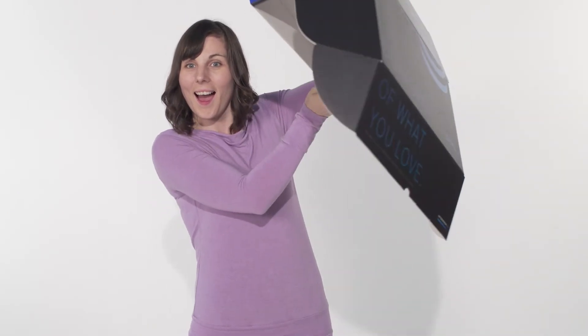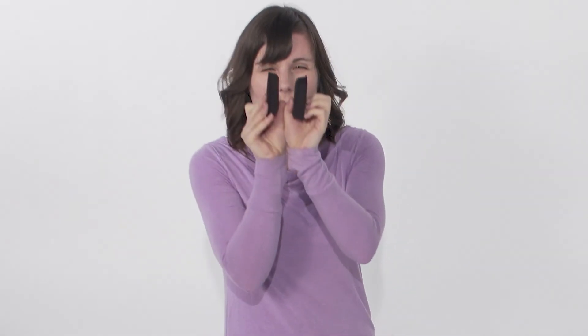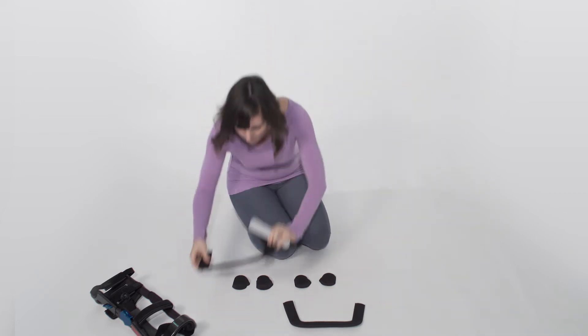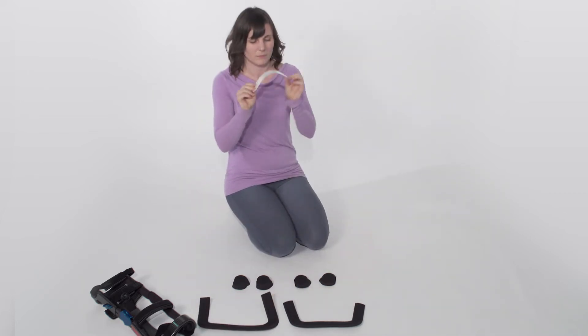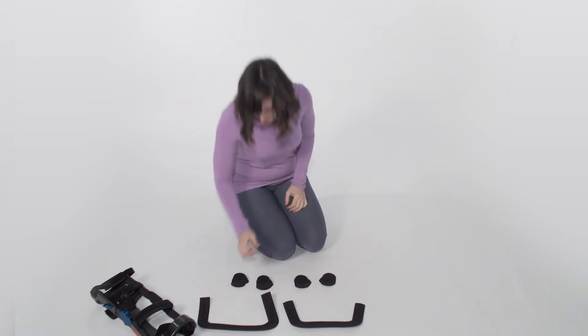Let's talk about brace pads. In your box you'll find four condyle pads and two U-shaped pads. The condyle pads come in two widths and the U-shaped pads in one. The U-shaped pads have two different sizes, one for the top and one for the bottom. All of your pads are covered in soft neoprene with velcro on the back.